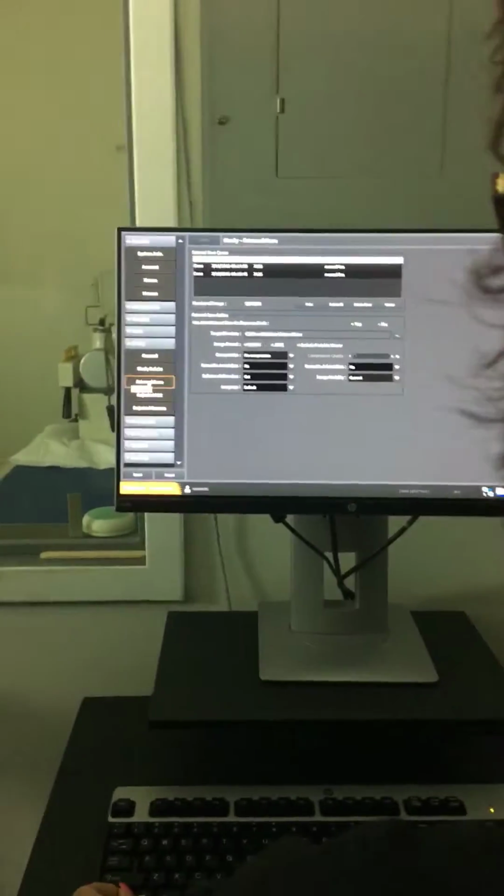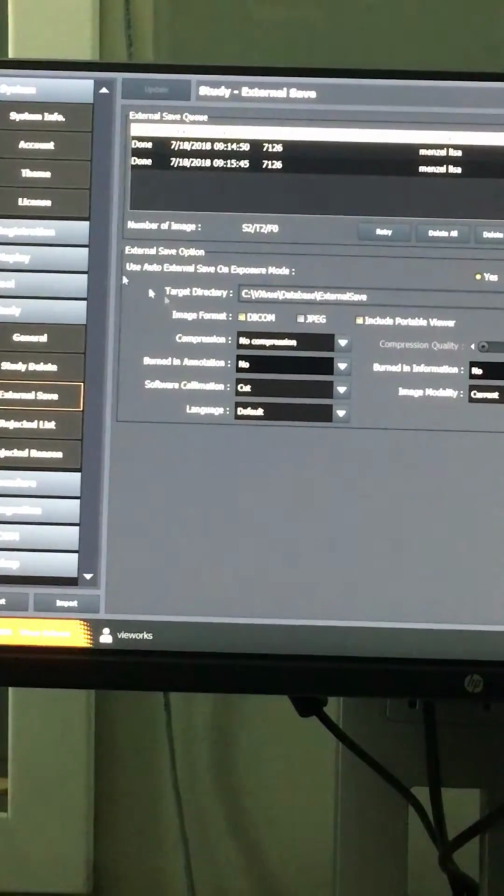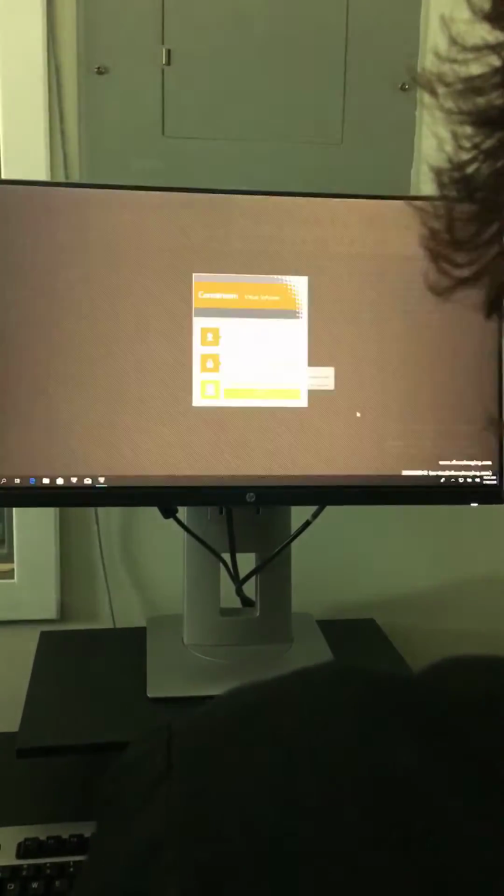I don't want to external save it though. Export. I think that's what you have to click on because she said export. Nope, that means when they save it. You don't have a shared drive in there that we can upload it to? No, because it's me, it should automatically come to me. Let me just exit and see what happens. I'll know if it came to me or not.